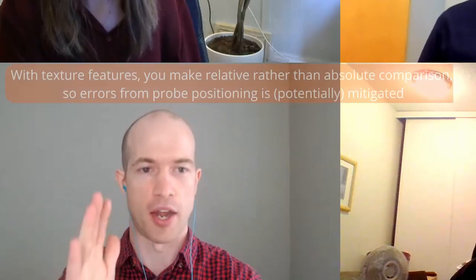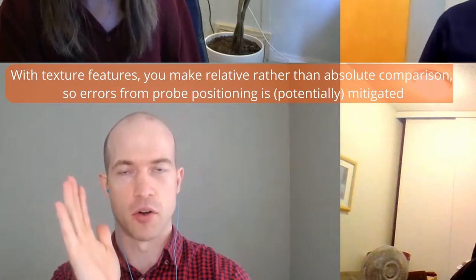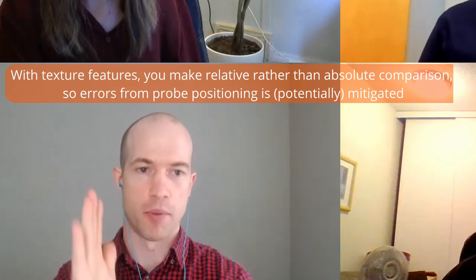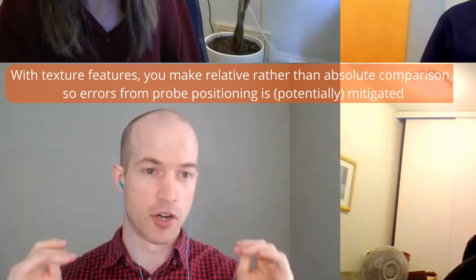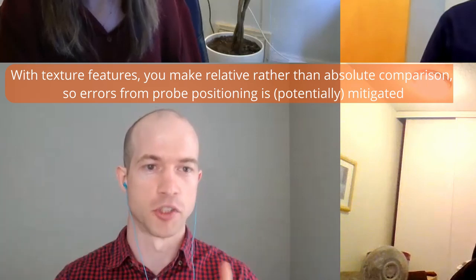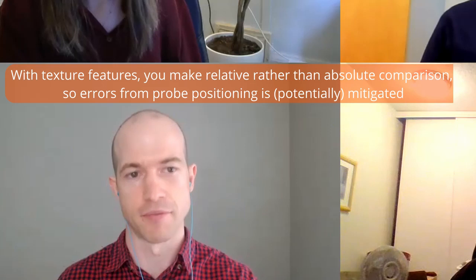The one nice feature about texture analysis in relation to echo intensity is that you're no longer worried about the absolute pixel values. If you tilt the probe a little bit, you might decrease your pixel values because you're no longer on a perpendicular plane. But because it's all about the relationships amongst pixels, as long as those are decreasing or changing to the same degree, that relationship won't change as much as the absolute pixel comparisons. So it might have increased reliability in that sense.